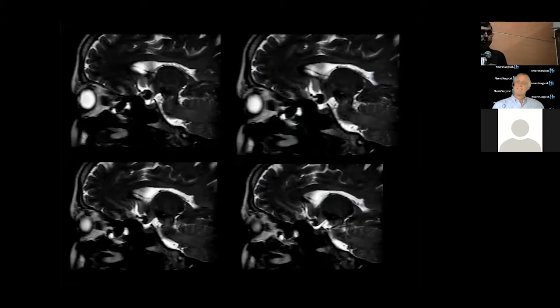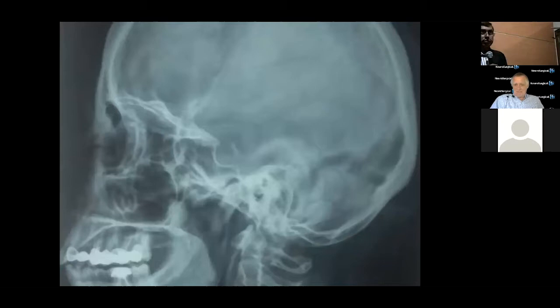Skull X-ray, somewhat enlarged sella. And I remember in the past when we did not have the MRI, our bosses used to ask us, what is the diameter of this and the diameter of this, the diameter in the third space, so that you can speak about the volume of the sella.